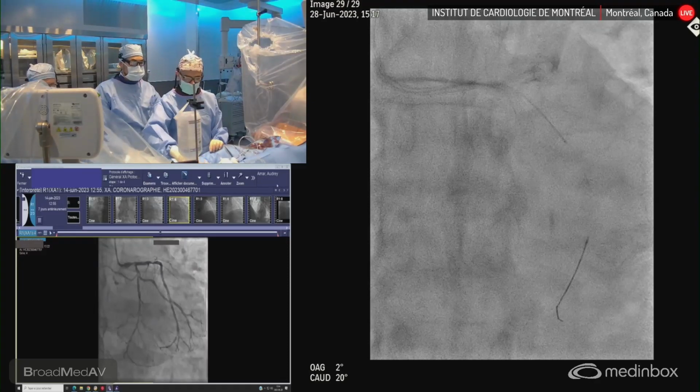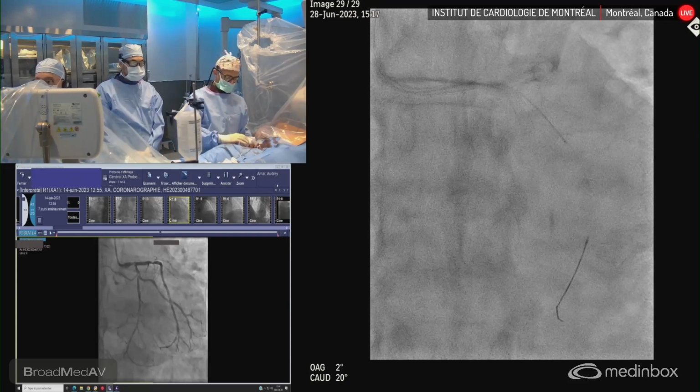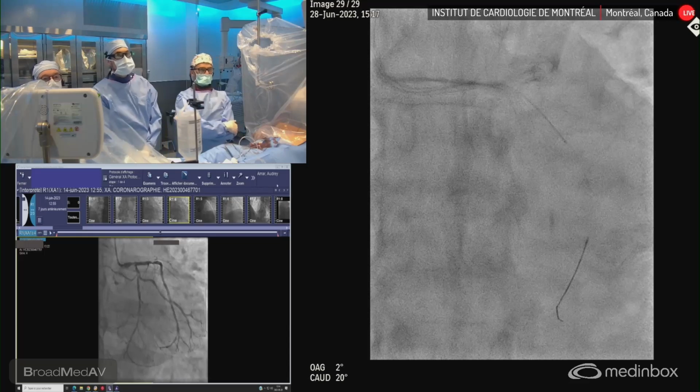There was a question about the femoral versus the radial approach. In this case, the patient had a spontaneous retroperitoneal bleed. So at some point we felt more comfortable with radial, and we have enough support now with our guide and wire. But it is true that if he had not had a history of a psoas hematoma, retroperitoneal bleed, we maybe would have gone femoral. But our main access is radial, with less local bleeding.